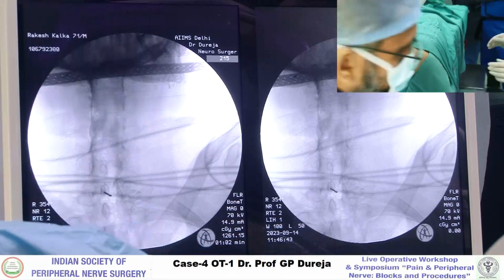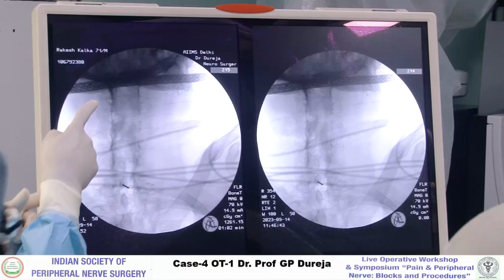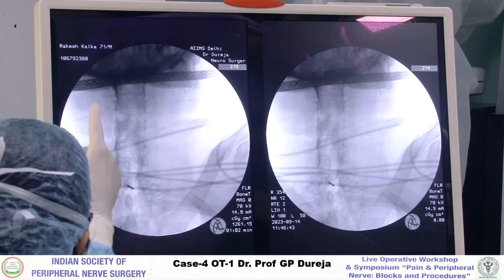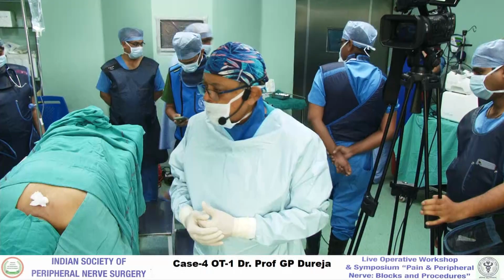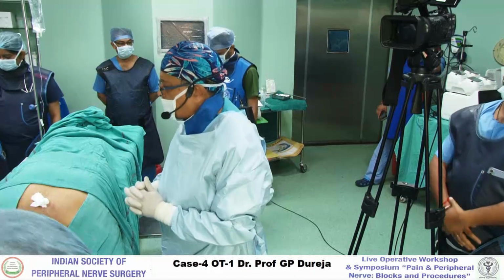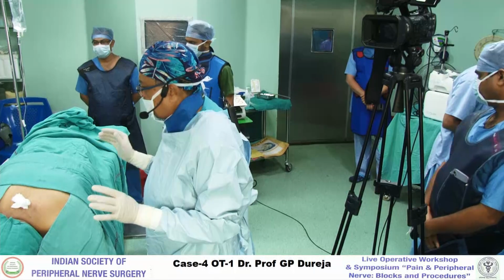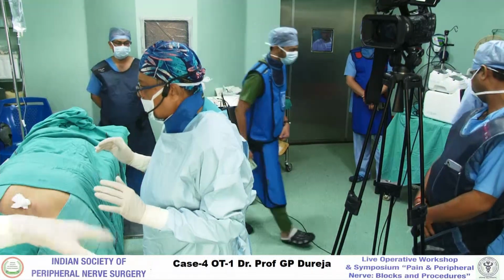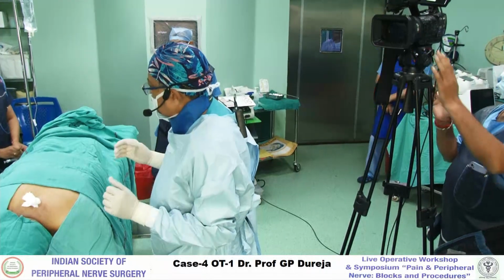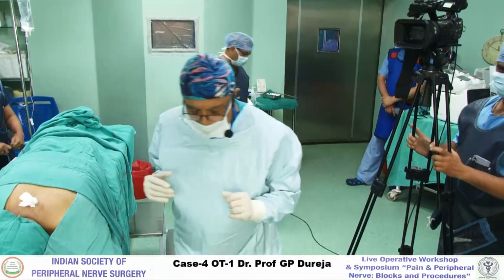Thank you, sir. Any questions from the audience? No, only if it is not going up. If it is going up, there is no need. I just wanted to, just for them. Dr. Dureja, one question: in this case you did not give Xylocard after the steroid. Yes. No, generally we don't give because we don't want to do a motor blockade of the cervical nerve roots. They are important roots, so I don't want to cause any motor deficit. Right. So specifically, it is an epidural. So even if I give 2 ml, it can cause some motor deficit. Right. Thank you, Dr. Dureja. Thank you.